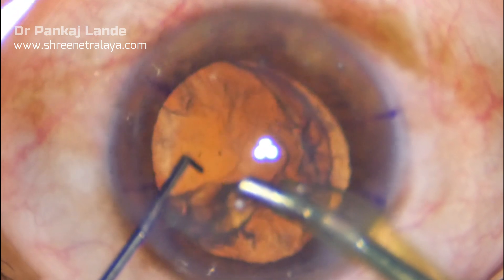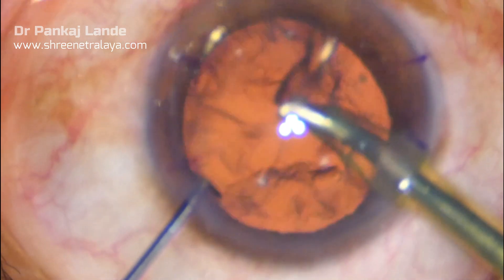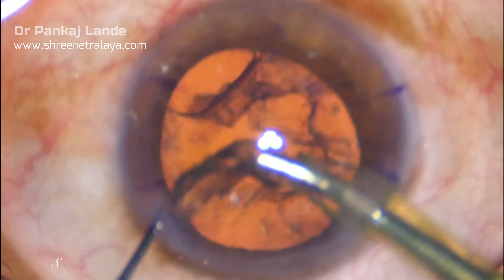For epinuclear plate removal, I usually shift the phaco pedal from position 3 to position 2 and finish the nuclear plate.